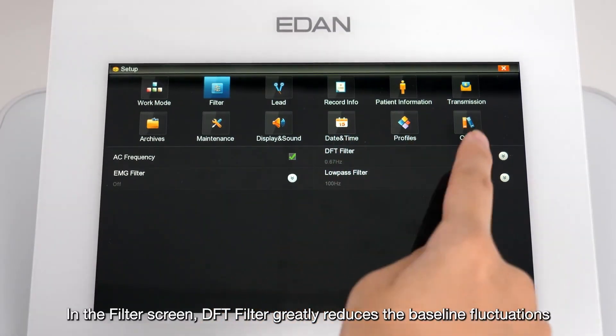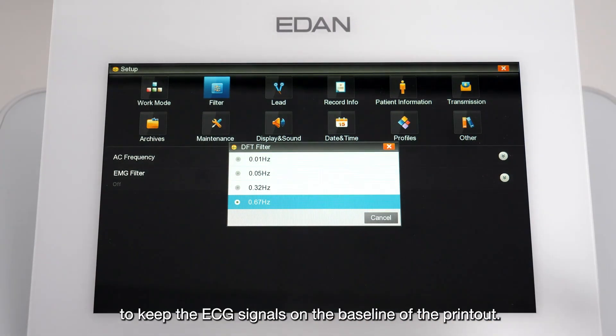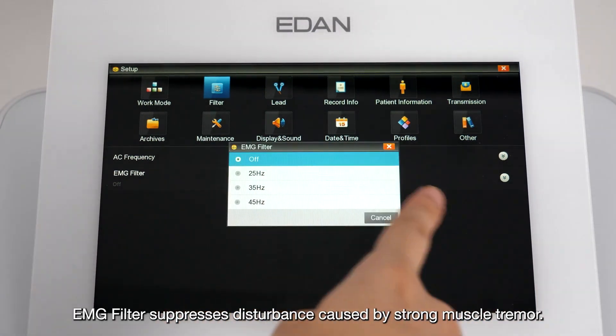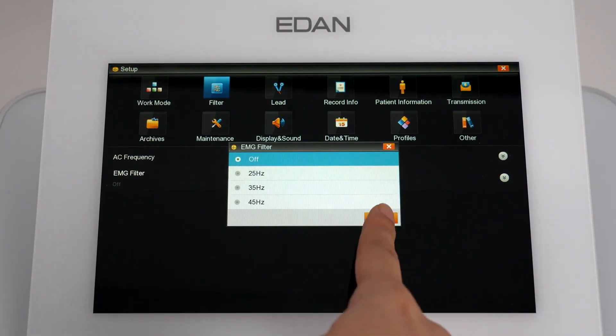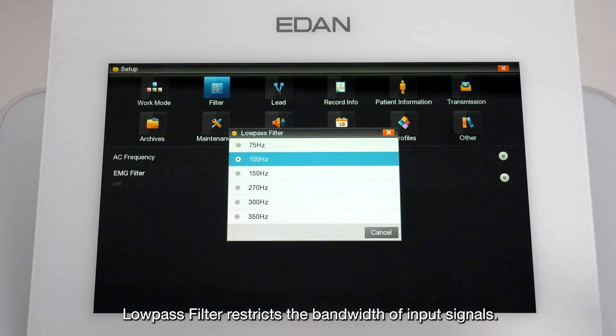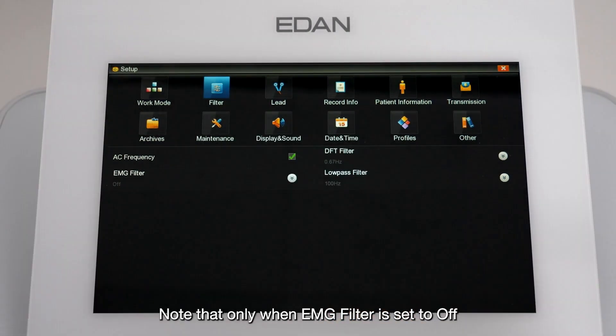In the Filter screen, the DFT filter greatly reduces baseline fluctuations to keep ECG signals on the baseline of the printout. The EMG filter suppresses disturbance caused by strong muscle tremor. The Low-pass filter restricts the bandwidth of input signals. Note that the low-pass filter setting is only effective when the EMG filter is set to off.